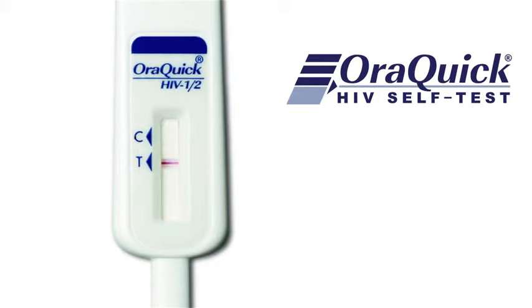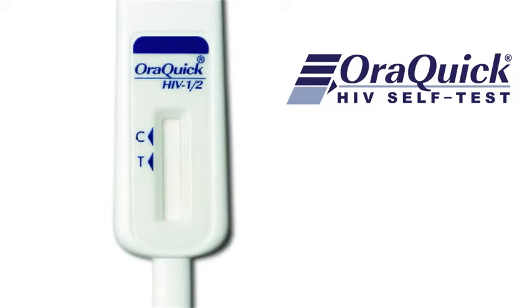If there is no line next to the C, or a red background makes it impossible to read the result, or if the line is neither next to the C or T, then the test is not working and you need to get another one.